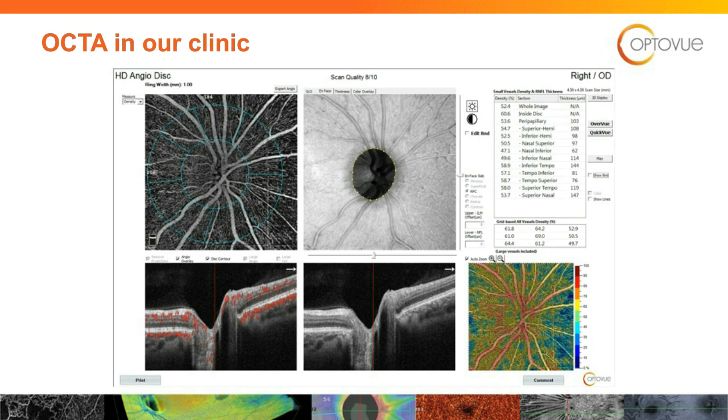And then very importantly, you want to go over to the left. Top left side, under HD Angio disc, you'll see there's a measure box. Click the down arrow, and you will see F.A.Z. You will see density. That's what we're looking at here. You will see flow. You will see non-flow. In your diabetics, I mostly look at F.A.Z and density, okay? And that's what that will look like.